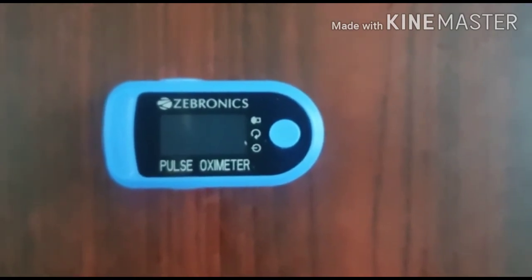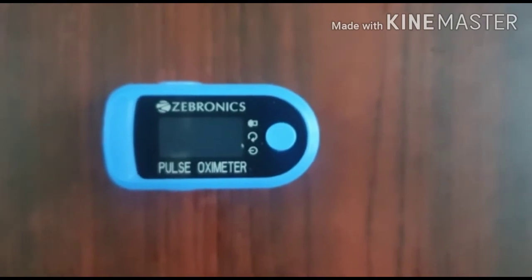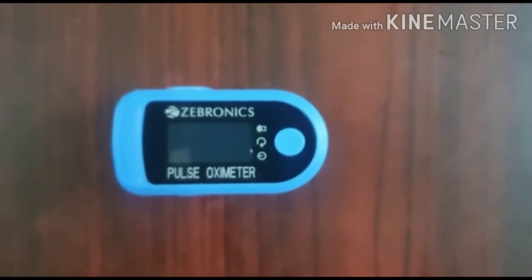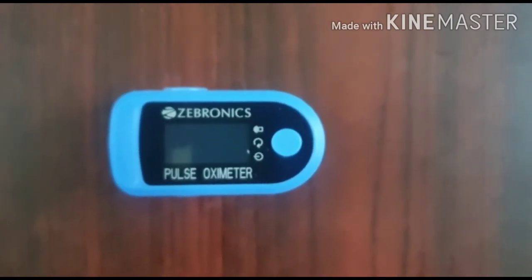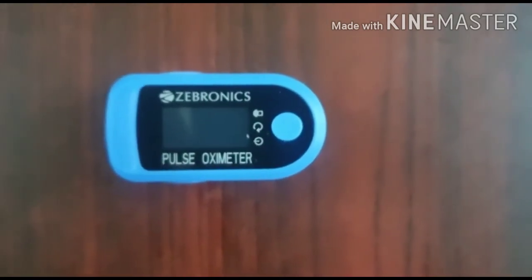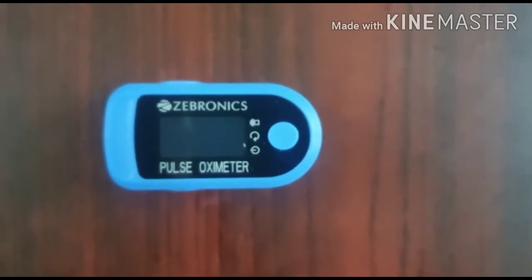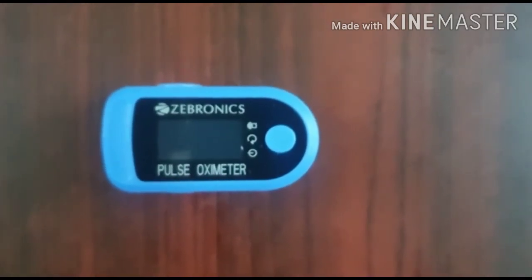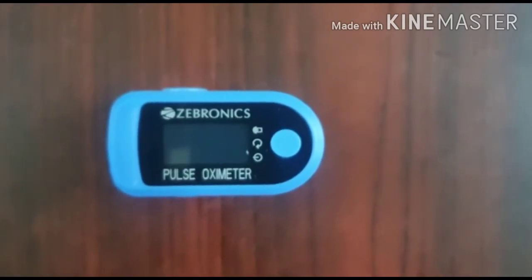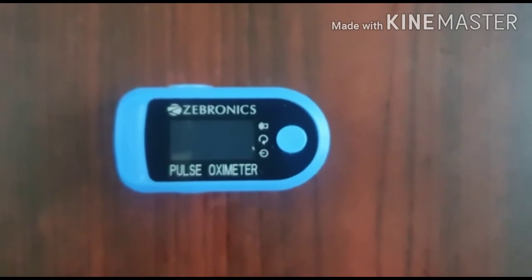Now let's talk about the important part — what these readings indicate. First, let's talk about the oxygen level. The oxygen level has to be more than 95. If it is between 92 and 95, it's an alert. If it's lesser than 92, it's better to visit the doctor immediately.